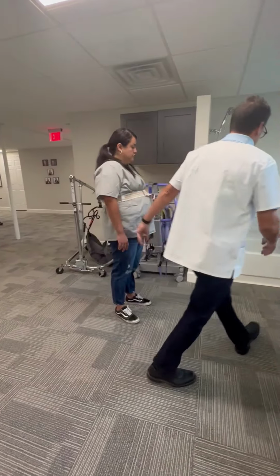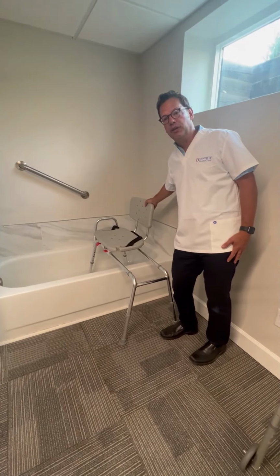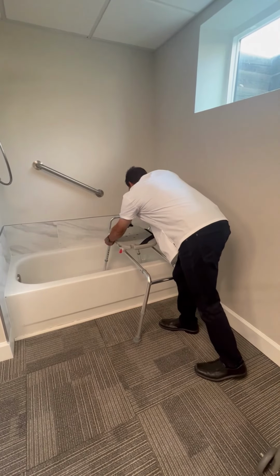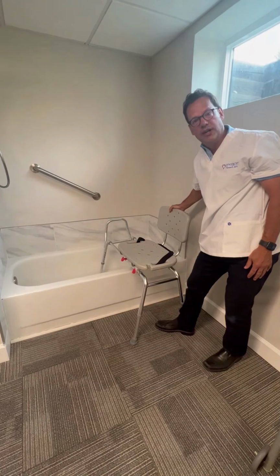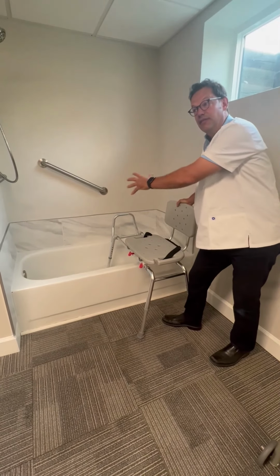Let me just talk to one element here. This is not a typical bench, which you will see. We like to use this in a lab environment so you know it's available. This seat allows our caregivers to move this seat into a position so a transfer can happen outside the tub safely. And again, we want you just to know that this is available.